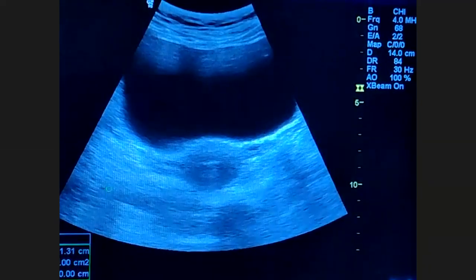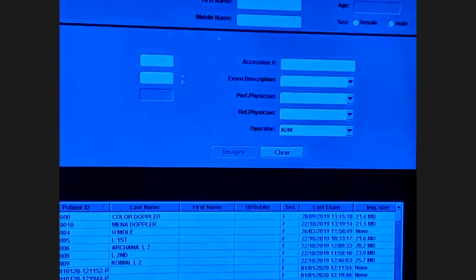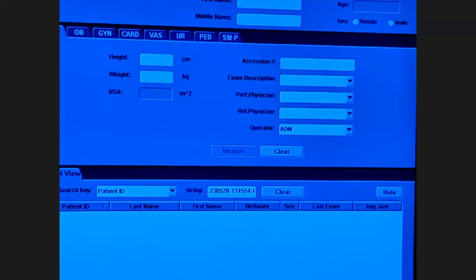This should be more than clear because we have already taken this thing in the practical sessions. Okay, so what I will do, I am rotating from transverse to longitudinal. That way, I am now having superior and inferior. I don't have a right and a left. Clear? Yes or no? Yes, sir.